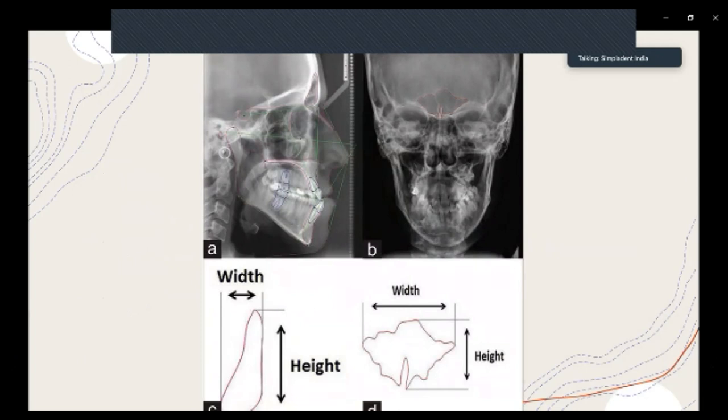So what is the idea of where you actually want to place a glabella implant? If we want to engage the floor of the frontal sinus, it is not that we can engage anywhere. As I told, you should remember the frontal sinus anterior-posterior width is maximum 1 centimeter, and 5 millimeter at the base, or the width of the base of the frontal sinus is also 1 centimeter.